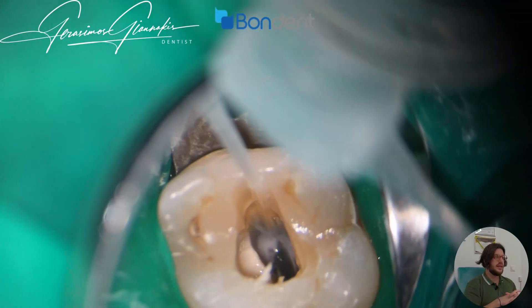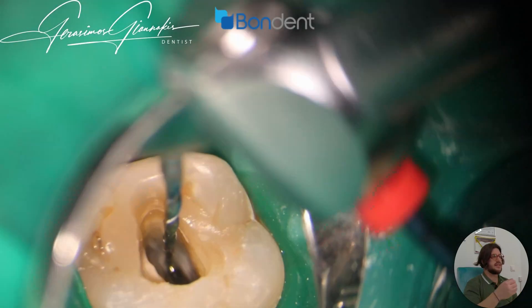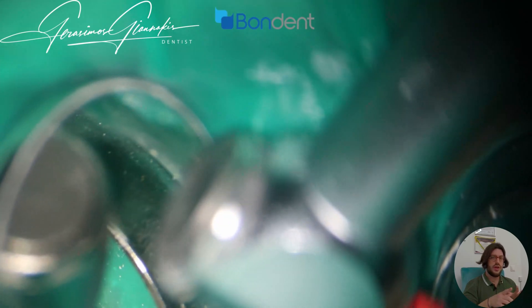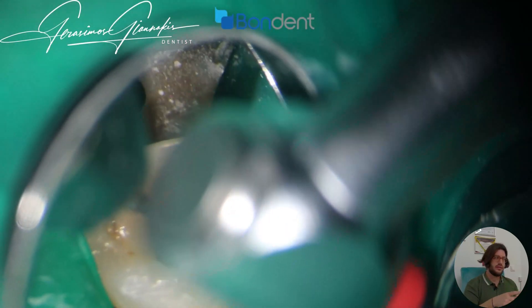Now again I can proceed with the pre-curved file, catching inside the canal. Because the handpiece has an integrated apex locator, when it has reached the working length, it will automatically stop and reverse.